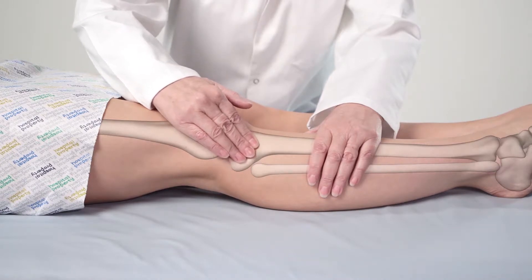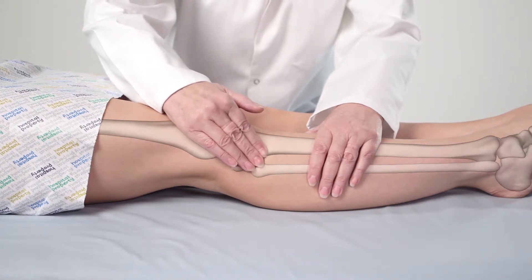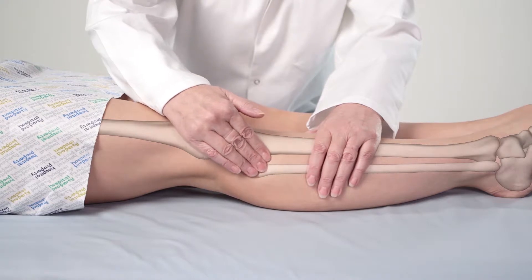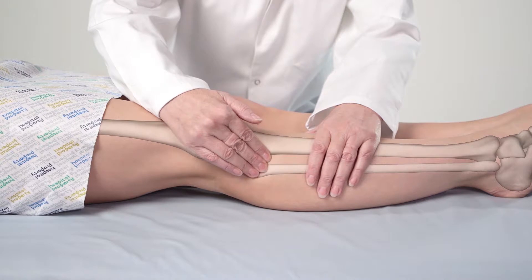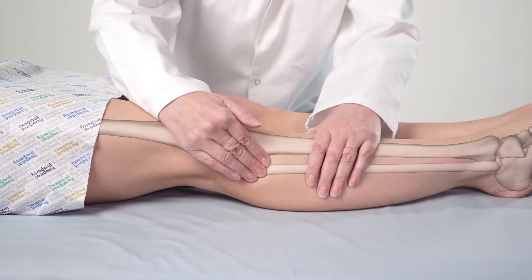Moving over the bone, continue towards the outside of the leg, and moving very slightly downwards, feel your way to the head of the fibular bone. It can be felt as a much larger and more rounded protrusion in comparison to the lateral condyle.